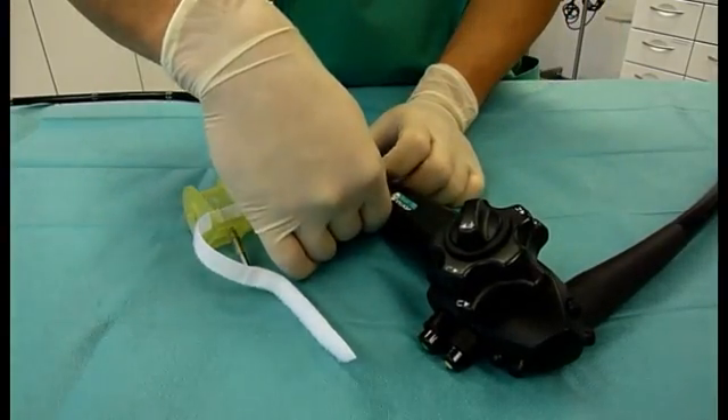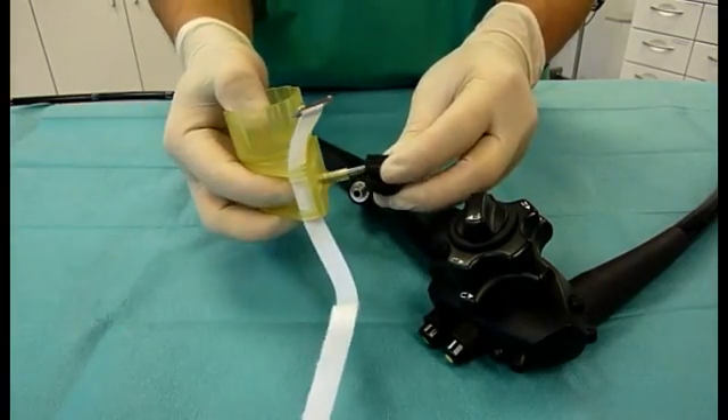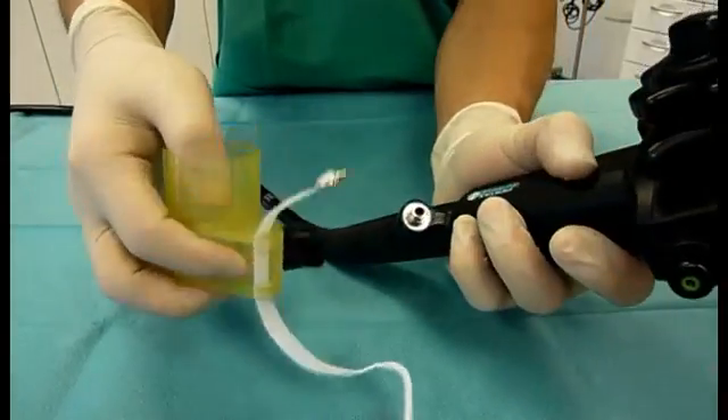The OTSC handwheel is inserted into the rubber valve on the working channel and attached to the endoscope's handhold using the Velcro strap.